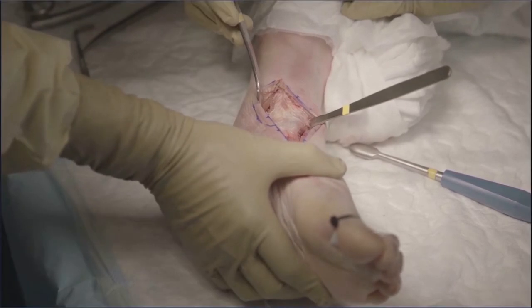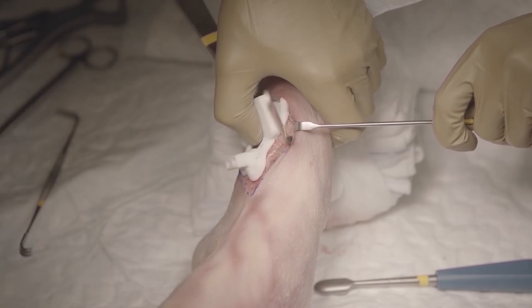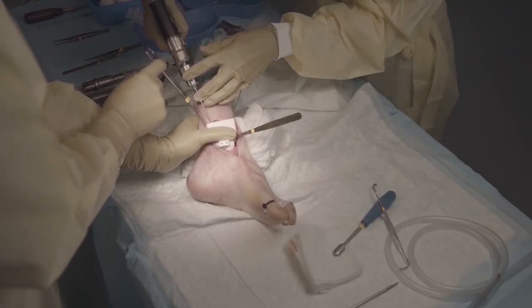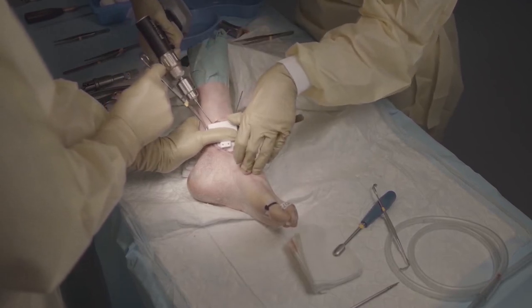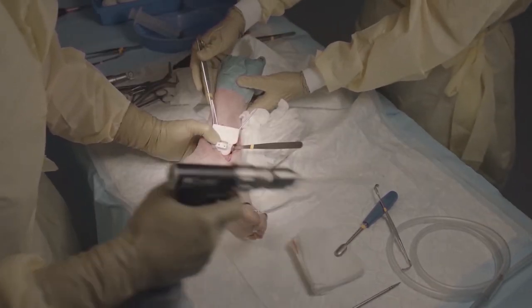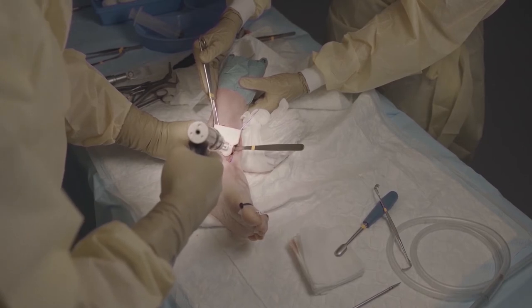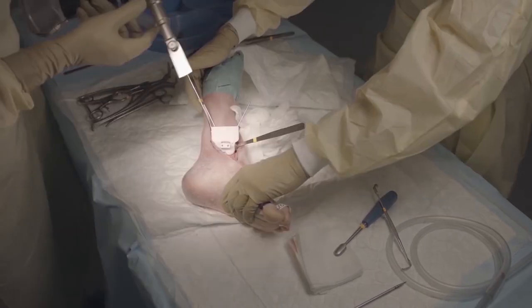Then we place the osteotomy guide — the patient-specific osteotomy guide — and we make sure that it fits onto the periosteum of the distal tibia and we secure it with two 2 mm K-wires. Then we pre-drill the two holes for the screws which we will later on use to secure the medial osteotomy, and typically these are 2.5 mm drill holes.